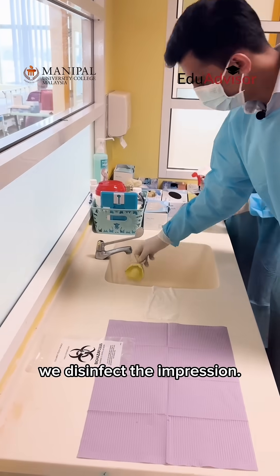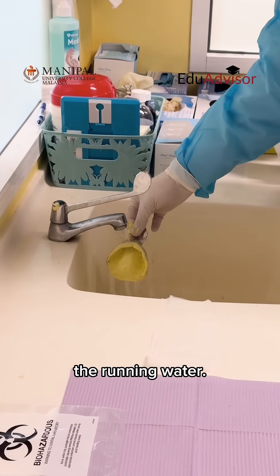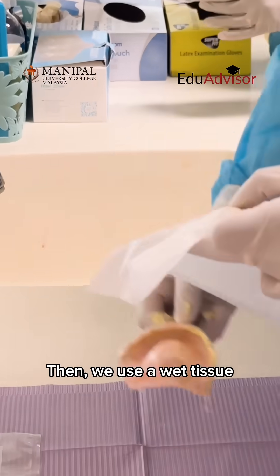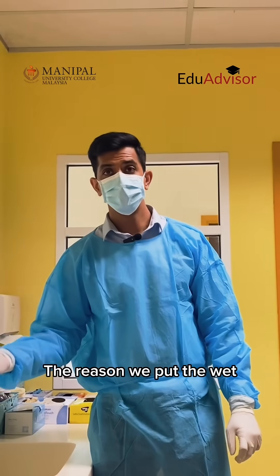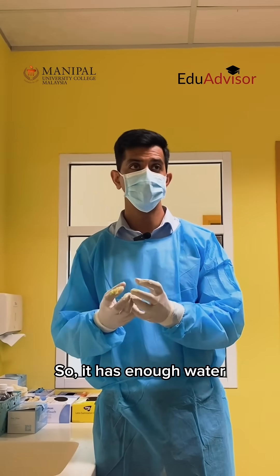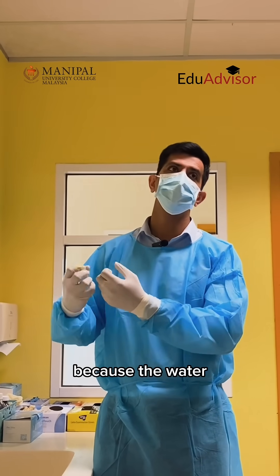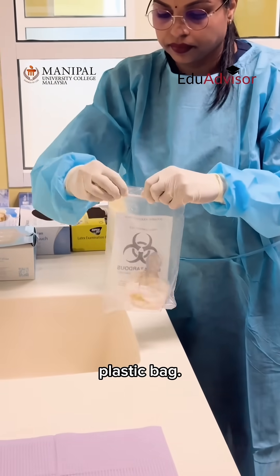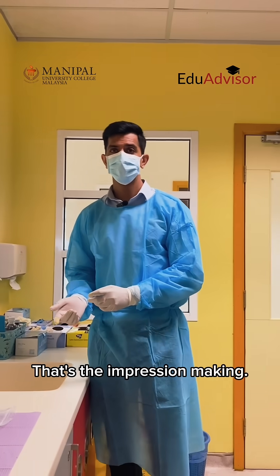After we've done that we disinfect the impression like this, wash it under running water. Then we have the dental assistant who would put a disinfectant for us. Then we use a wet tissue to cover it up nicely. The reason we put the wet tissue paper on top is so that it doesn't get dry — it has enough water to hold on for some time. But as it goes on it starts shrinking because the water starts dissipating out of the impression. Place it inside the plastic bag, and that goes to the dental lab. So yeah, that's the impression making.